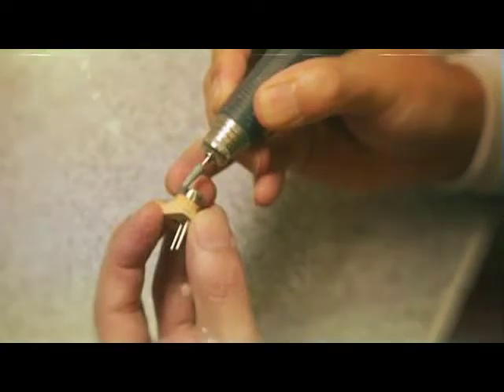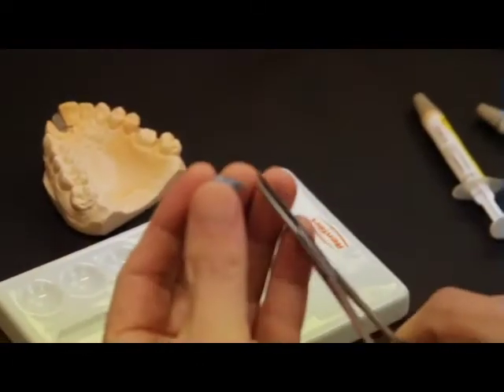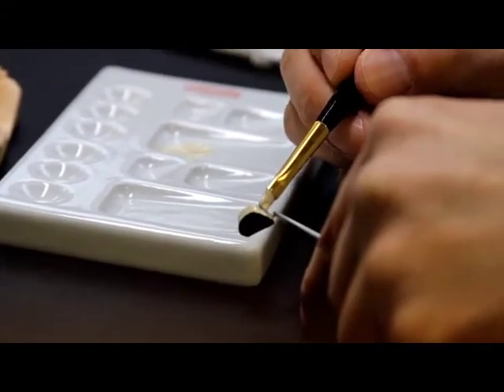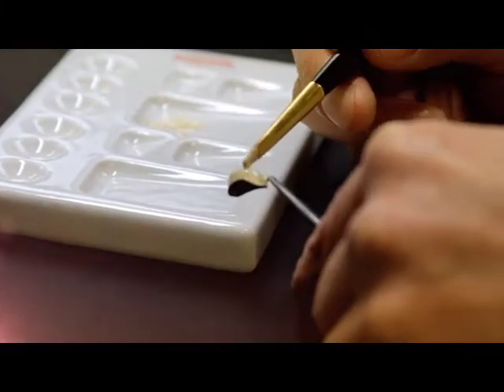Cast or CAD-CAM made metal frameworks are finished using tungsten carbide metal burrs or ceramic bonded grinding instruments and oxidized according to alloy manufacturer's instructions. Apply the first opaque layer or wash layer with the GC Initial MC Paste opaque in a thin layer using a flat brush.